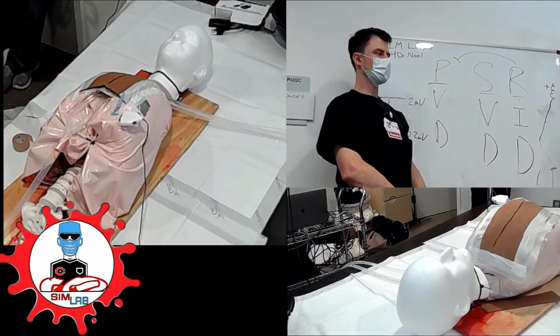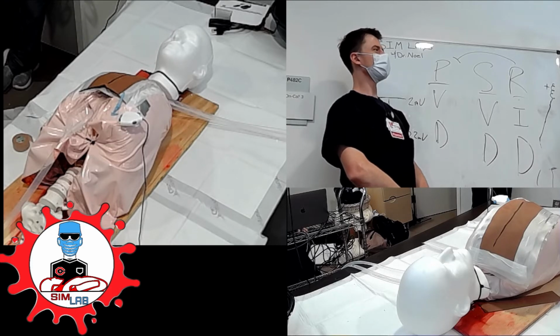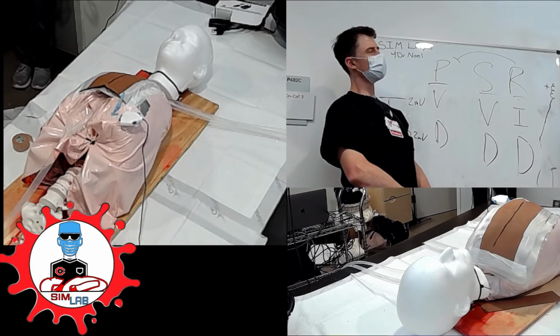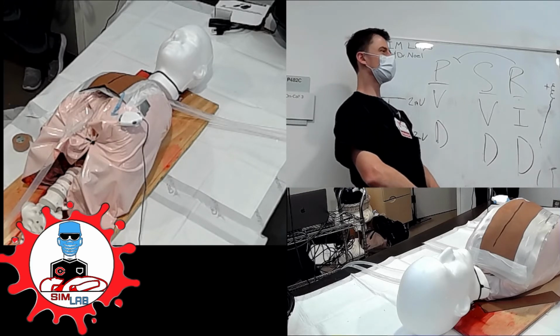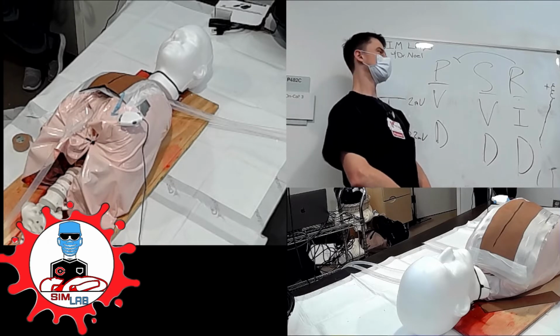When you say go up on PEEP, like what are we talking about? Are you going up to like 10, or are you going like 20, or 40? Yeah, like physiologic values. Not just a little bit of PEEP. So like go up from, you're on 5, go up to 8. And 8, go up to 10.